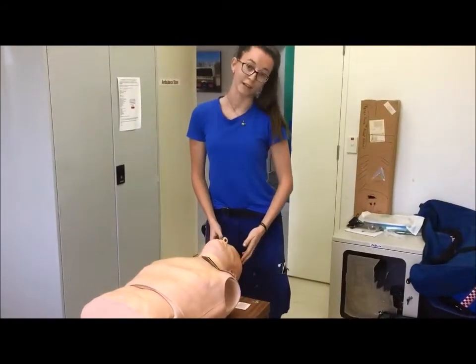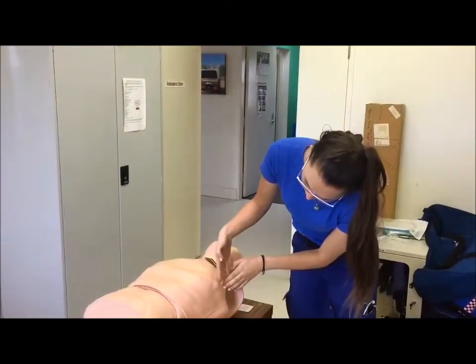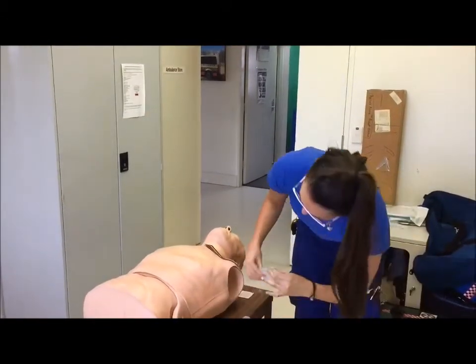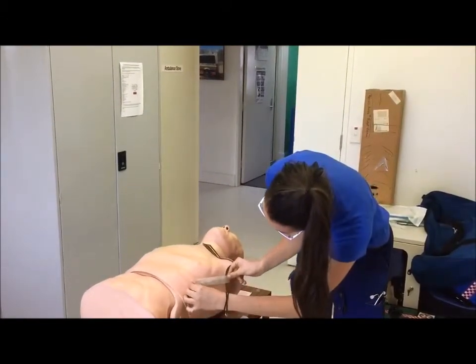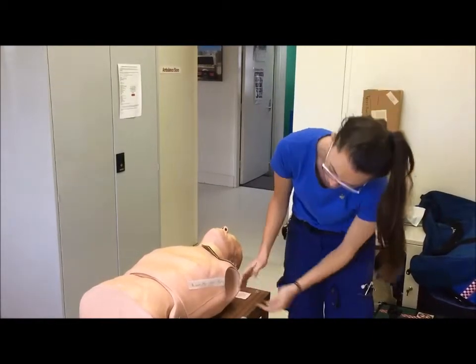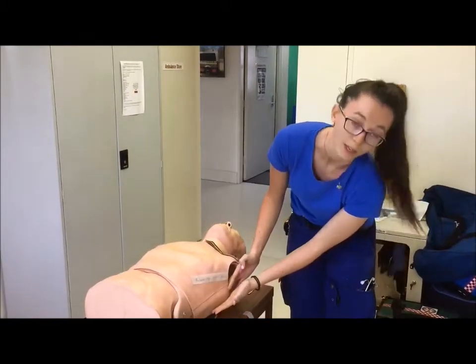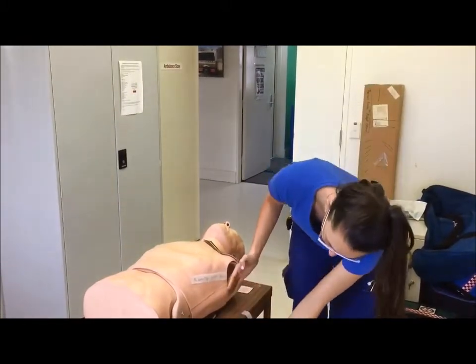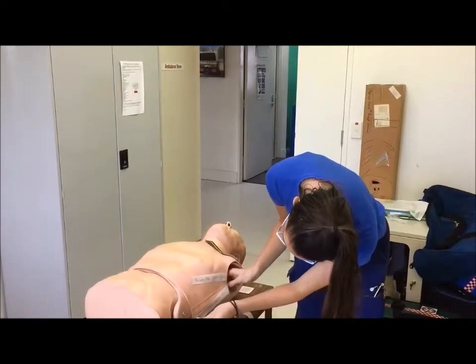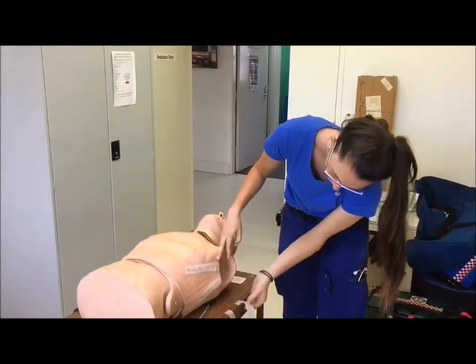Next, we need to identify our landmarks. So the first one is the lateral border of the pectoralis major muscle. What we are looking for here is the triangle of safety. Our second anatomical landmark is the anterior border of the latissimus dorsi. Third, we want the base of the axilla.